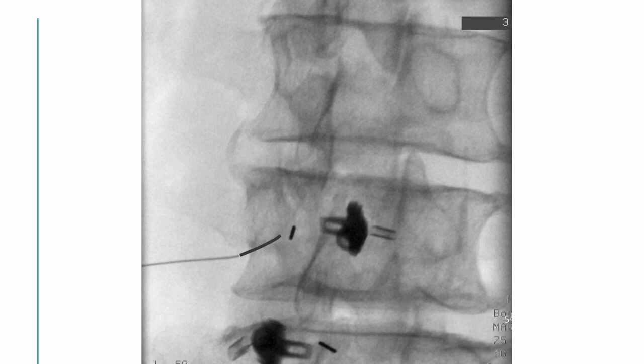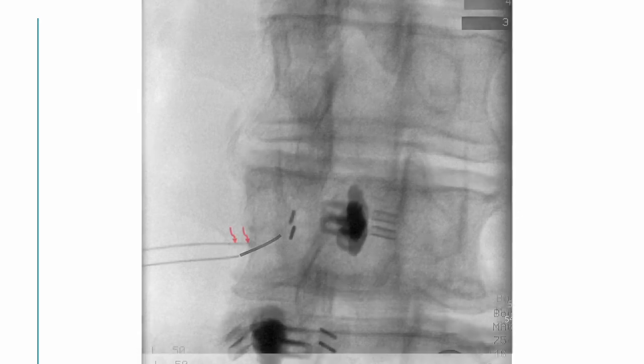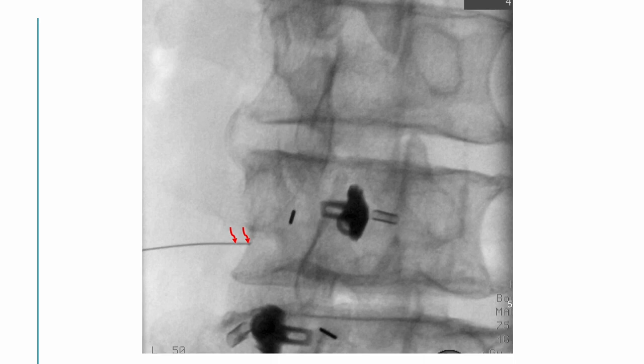Ideally, the needle should move there, but the needle bounced another way due to an unexpected bony structure. This happens frequently. Sometimes the imaging is not enough to visualize the thin bony structure. At that time, I must reset the realistic target and proceed with the process.